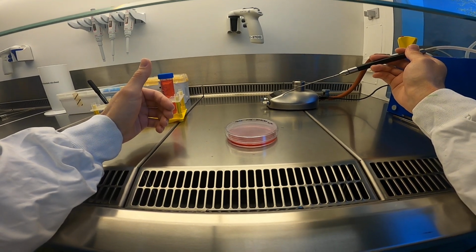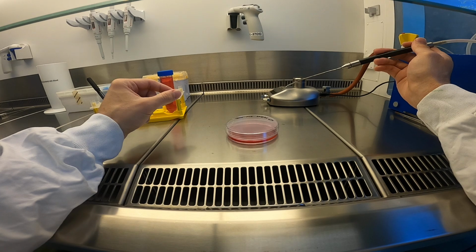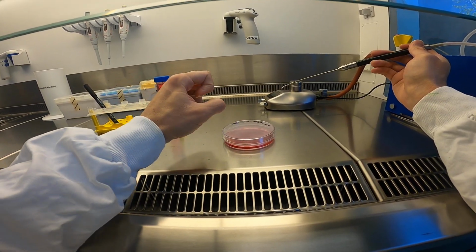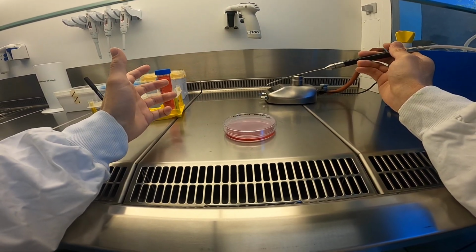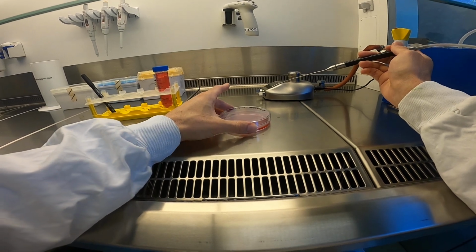The reason you need to wait for it to cool down is because if you put it directly in there, two things will happen. One, your cells will boil alive, and two, because of the temperature difference, the liquid will actually just explode. It will splatter everywhere and there will be a big mess. So we want to avoid that, and that's why we wait for the needle to cool down.